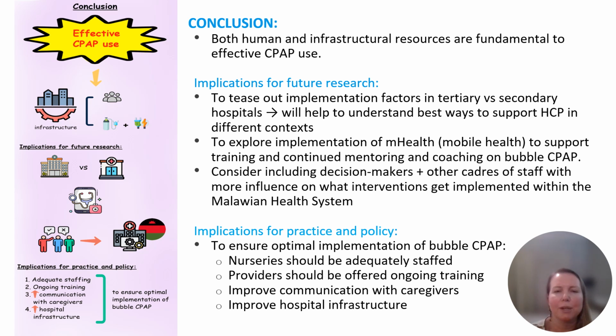Implications for practice and policy. To ensure optimal implementation of bubble CPAP, nurseries should be adequately staffed, providers should be offered ongoing training, and communication with caregivers and hospital infrastructure should be improved.